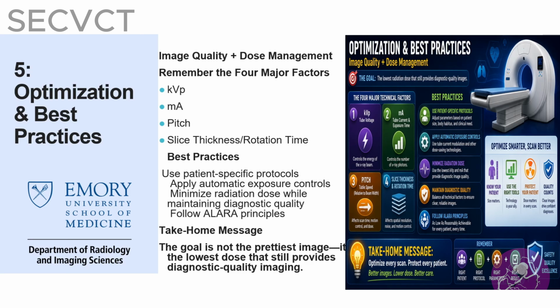One thing, most people that know me know I'm a perfectionist. And when I go back and read reports, one thing I do not like to see is mid-RCA is not diagnostic, or proximal LAD is not diagnostic. I don't like to see non-diagnostic anywhere in one of my reports from my physicians. So the take-home message: the goal is not to have the prettiest image, even though that's my goal. The goal is not, most of the time, to have the prettiest image, okay? It is to have the lowest dose possible and still provide diagnostic quality images.